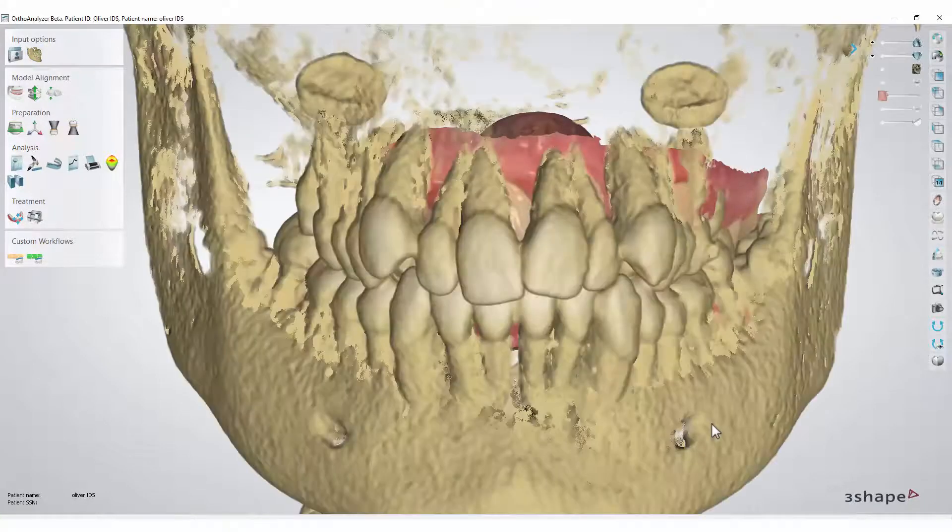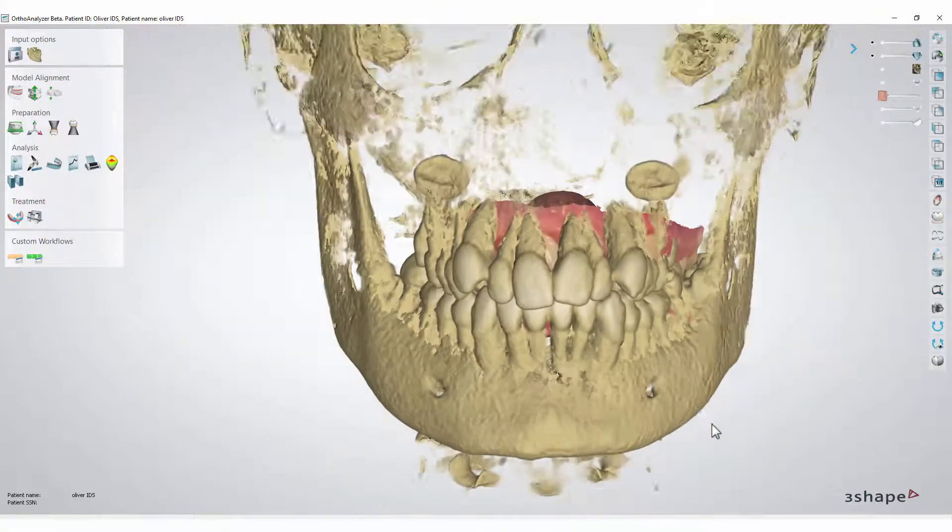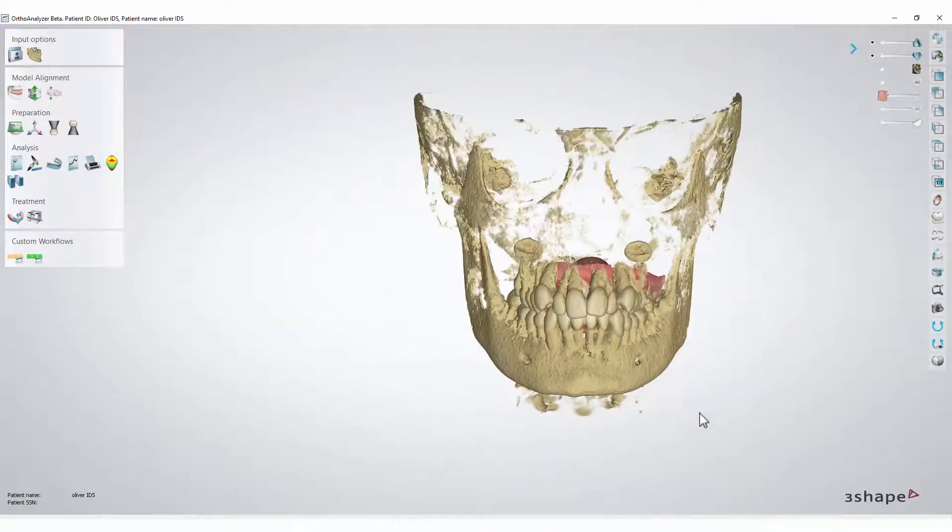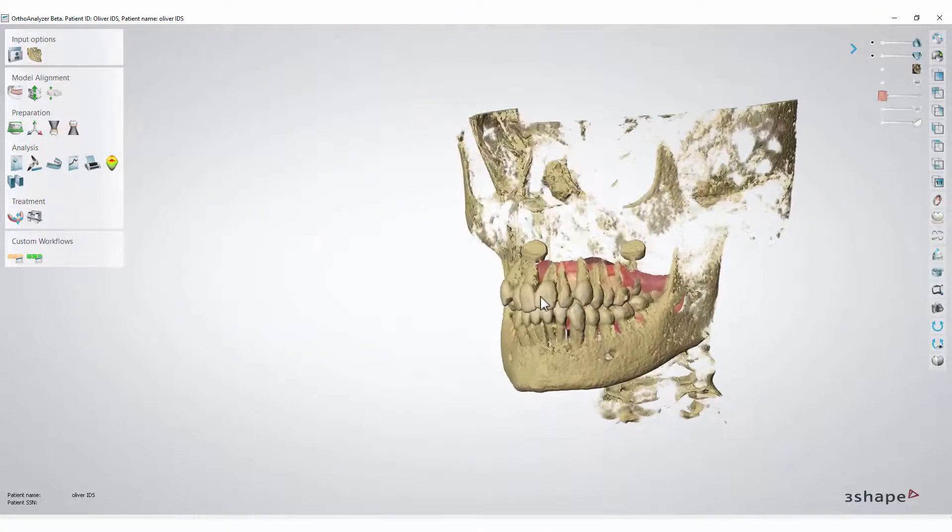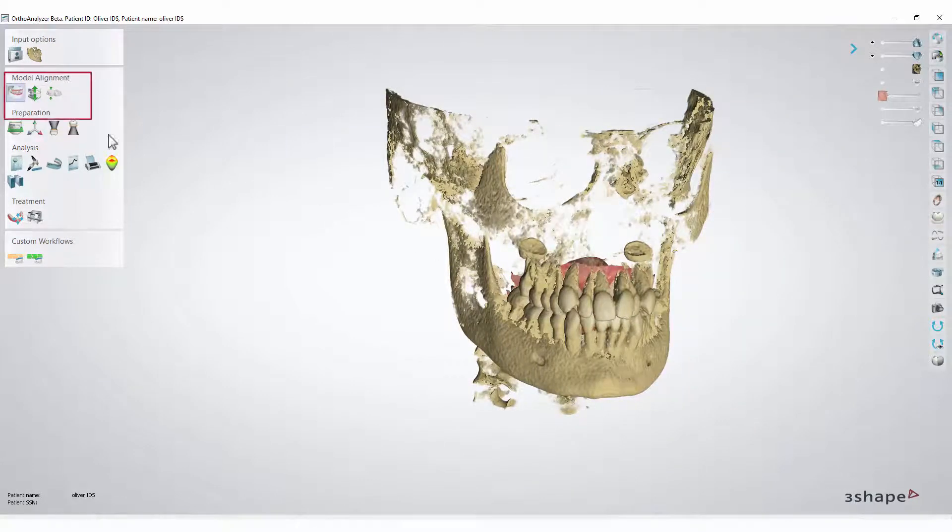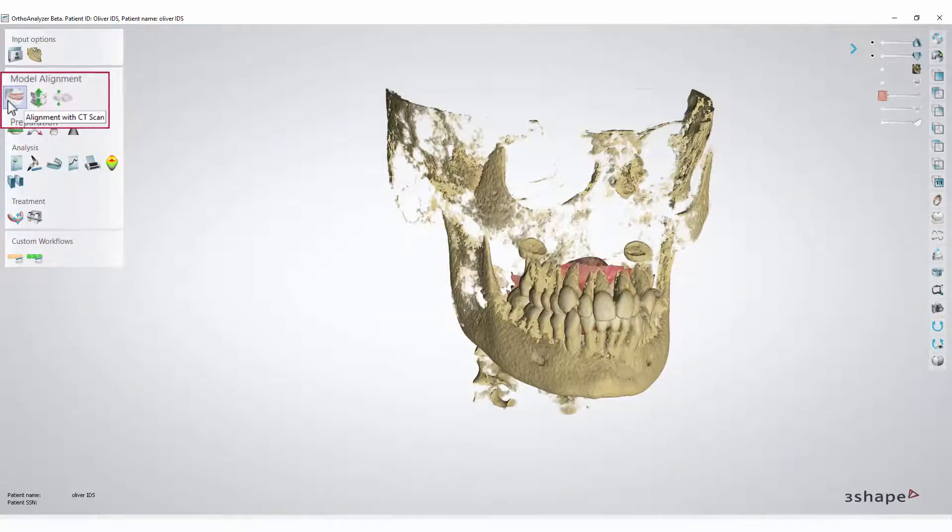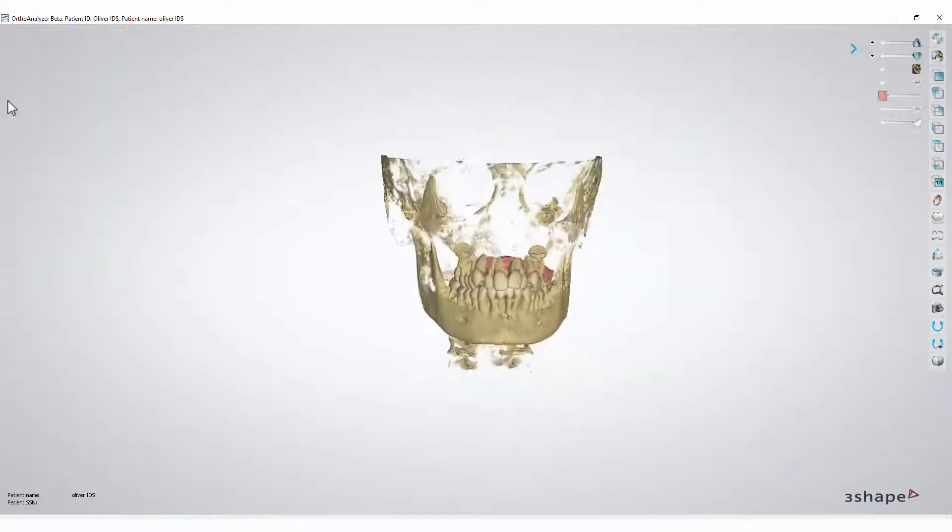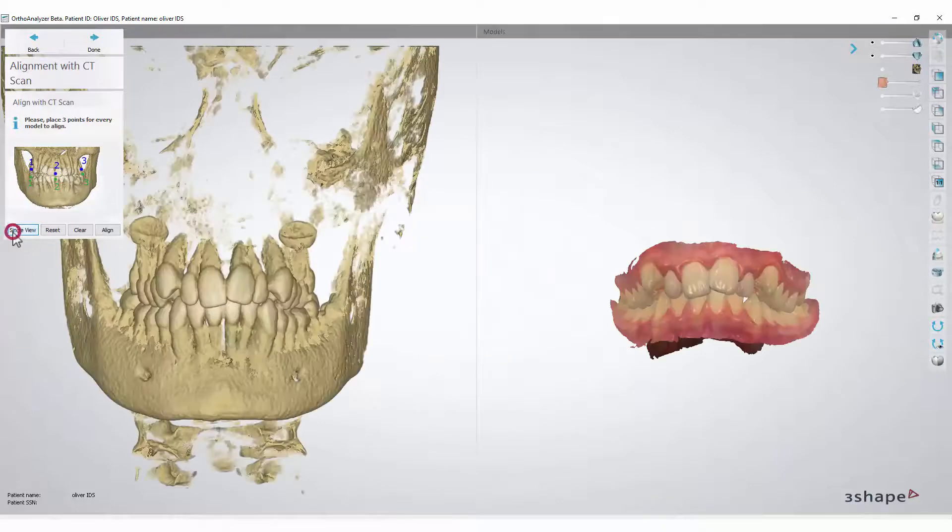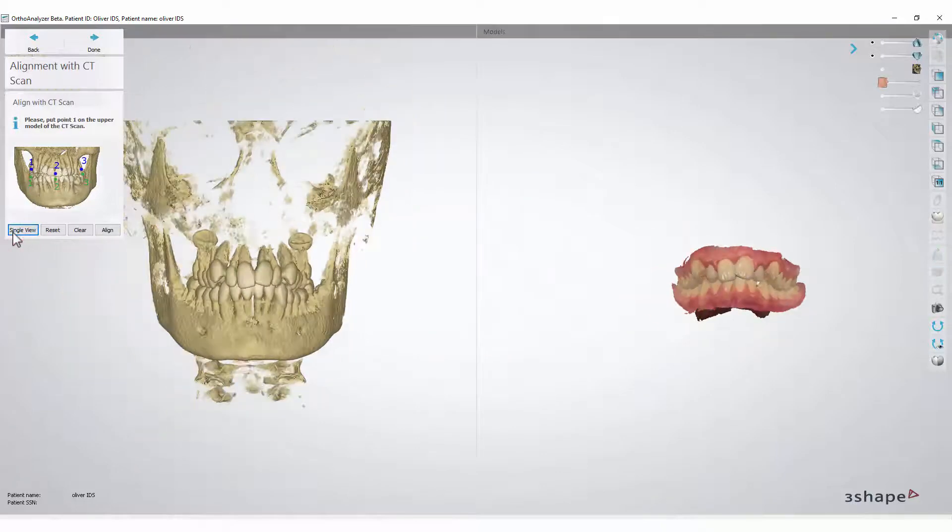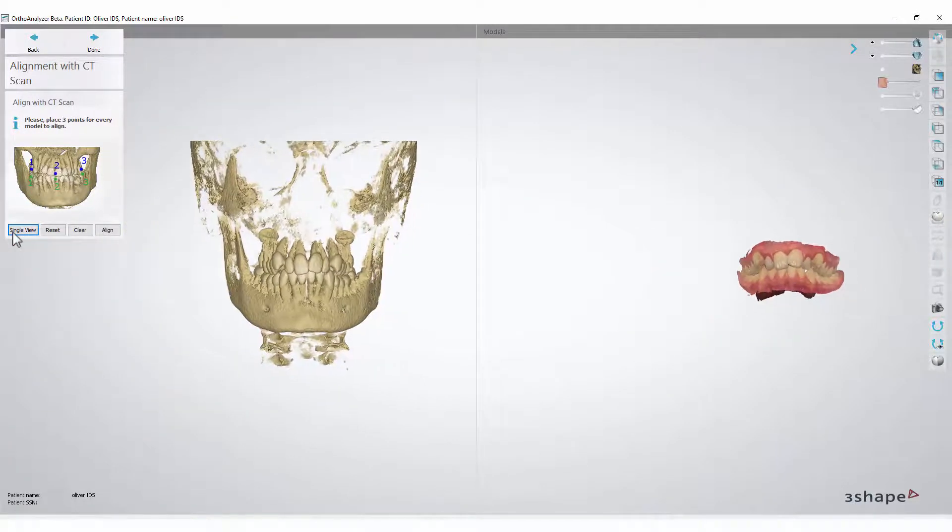Now, the CT scan must be aligned with the model set. To start, click the Alignment with CT scan button. Then click Dual View so that you can see both the model set and the DICOM scan, side by side.